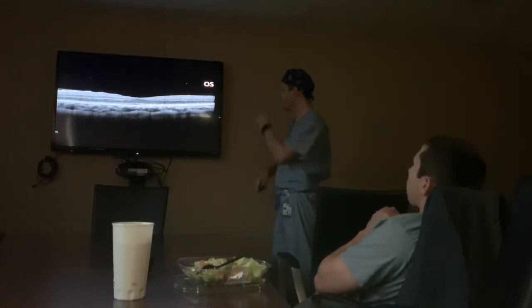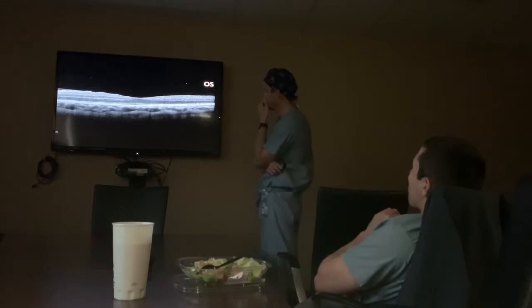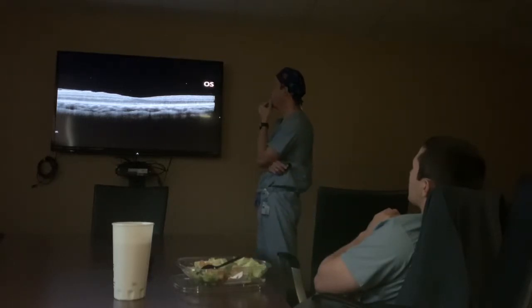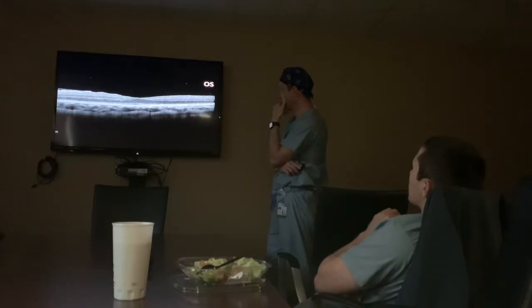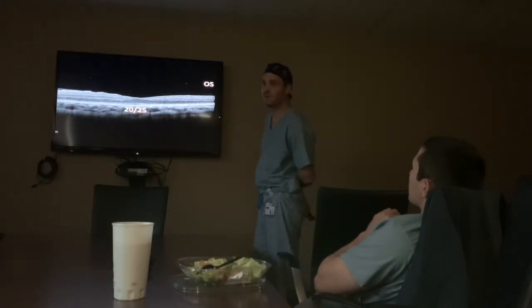This is the affected left eye on a horizontal line scan. There's no PVD, there are rare vitreous cells. In the outer retina it doesn't look perfect — it's a little ragged at the receptors. The inner retina has some undulations.